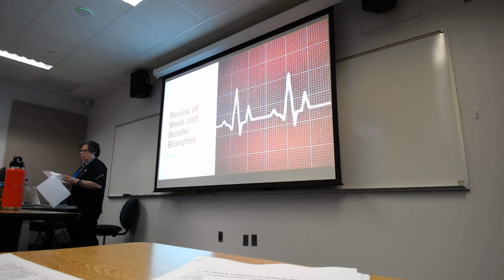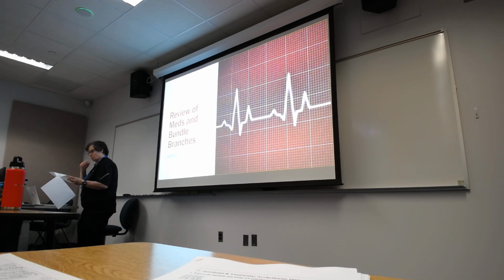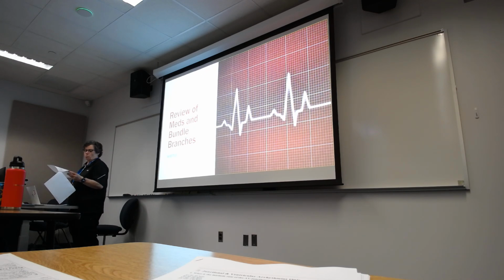What differentiates ventricular tachycardia from supraventricular tachycardia with aberrancy? Actually, fusion or capture beats. So we'll have to look at that more closely. SVT, if it has an alternate pathway, can appear wide. It's hard to discern on your EKG. You have to have a 12 lead, and you're going to have 5 cardiologists all have a different opinion as to whether it's VTAC or SVT with aberrancy.